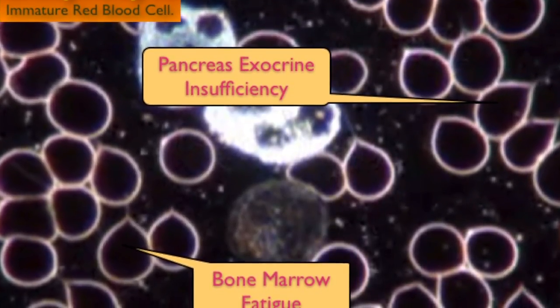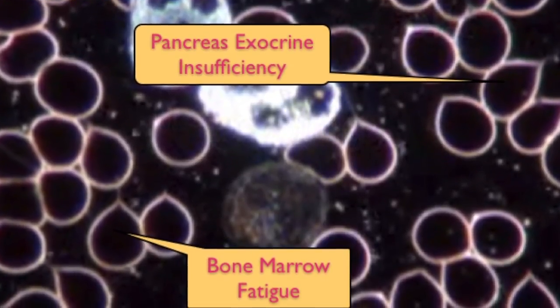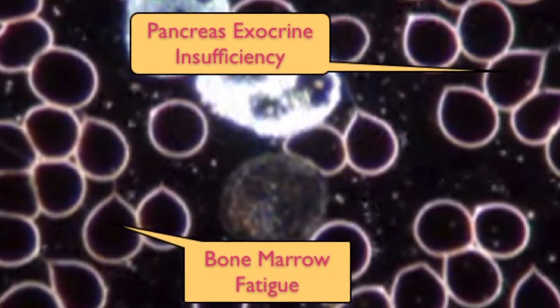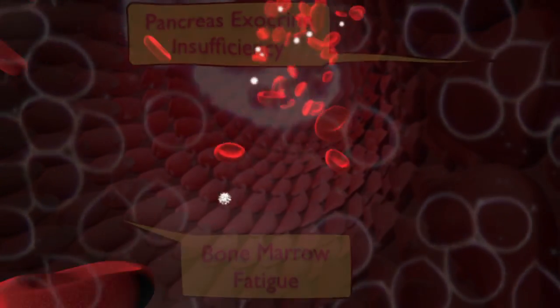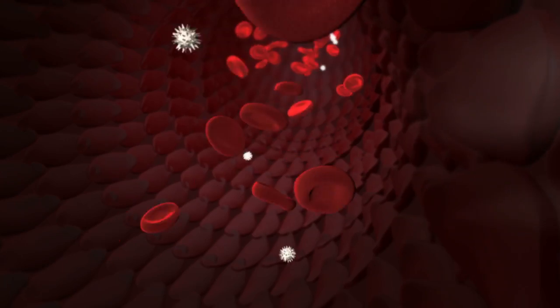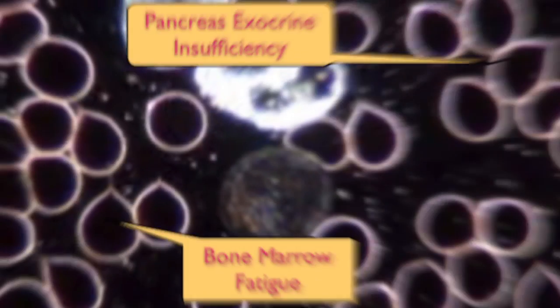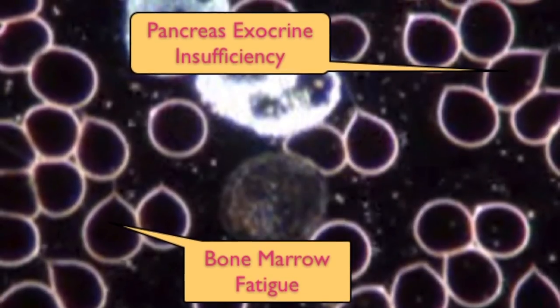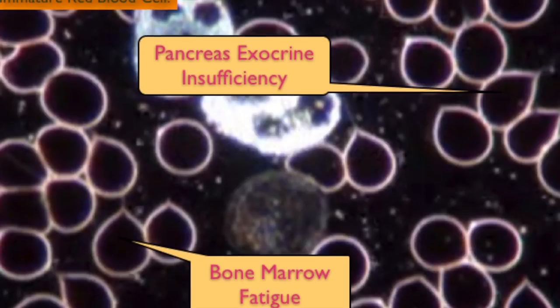In squeezing through the tight fibrosis in the marrow and in navigating through the markedly enlarged and cellular spleen, the red cells take on an unusual teardrop shape. You can almost see how they drag themselves through the tight spaces, stretching their bodies into elongated, pinched shapes. Another word for these teardrop shapes is dacrocytes.